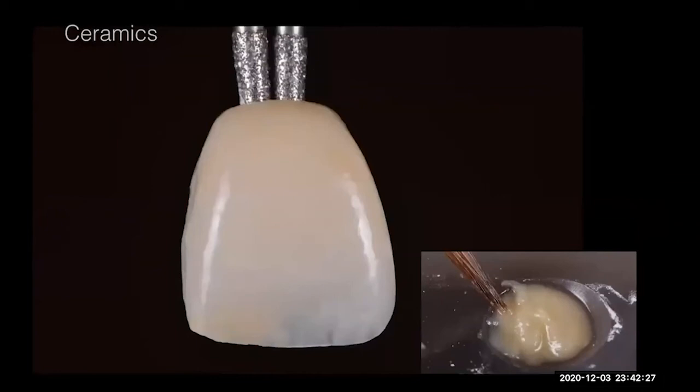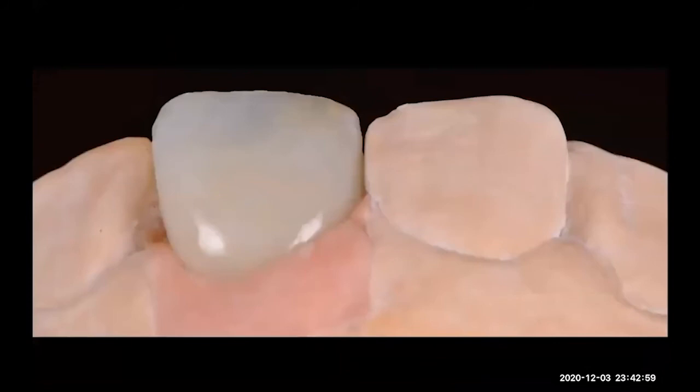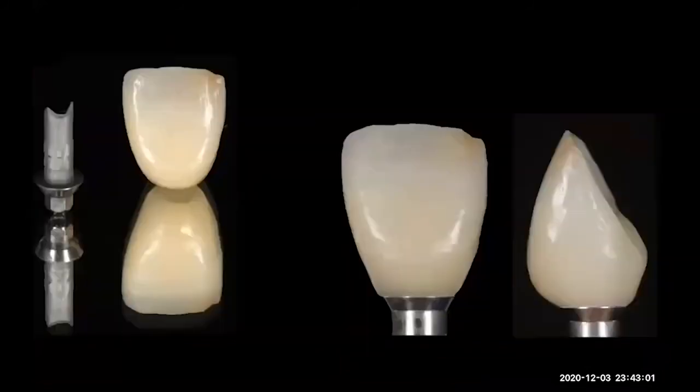This tooth has a special characteristic from palatal, so we use the material from Sascha Hain, where you mix the liquid with the ceramic and you can see the real color in the ceramic. We use that technique too, and you can see here in the incisal edge of the central the yellow color. And then this is the crown glazed.